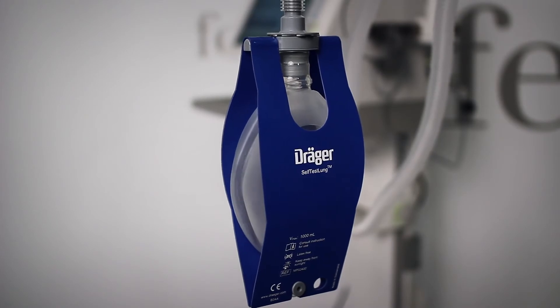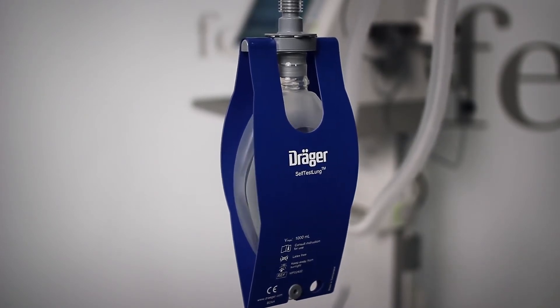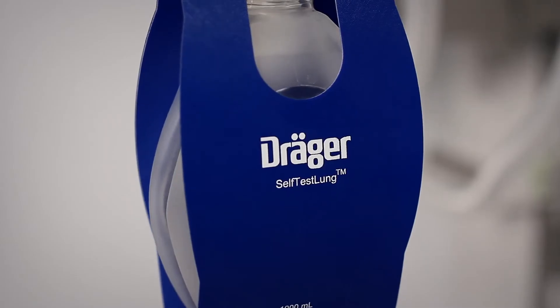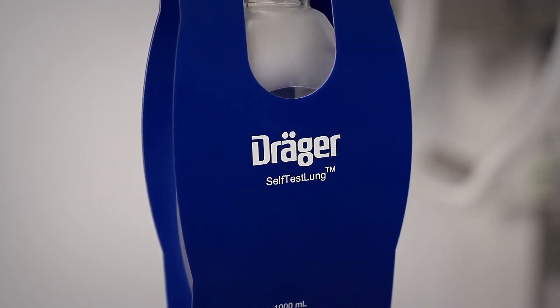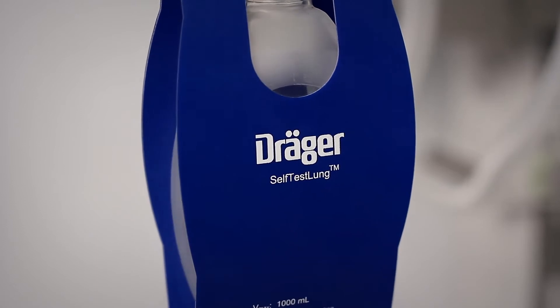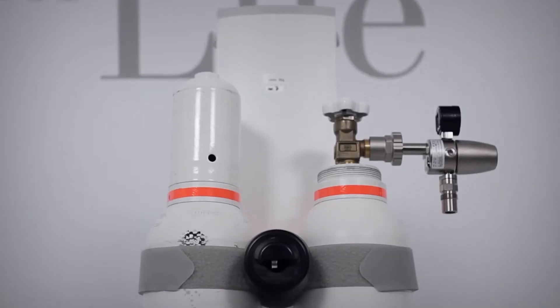For ventilation, Savina 300 uses ambient air which is supplied by an internal turbine. In the high pressure oxygen mode (HPO), O2 supply is provided by a central gas supply system or by compressed gas cylinders. In the low pressure oxygen mode, O2 supply is provided by an external low pressure oxygen source, for example an O2 concentrator.